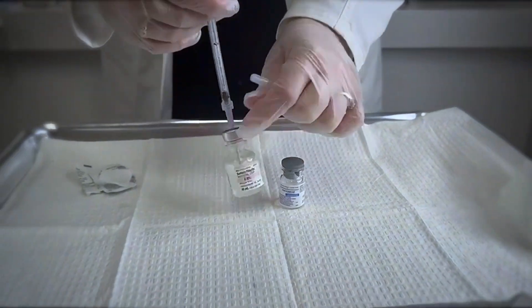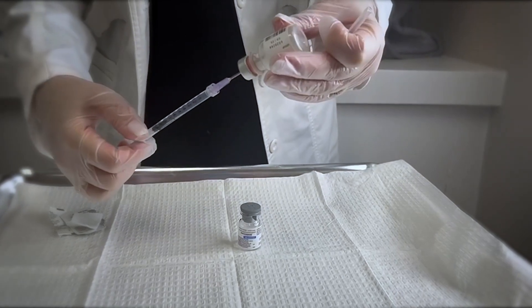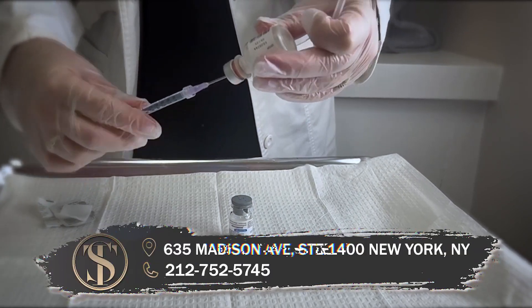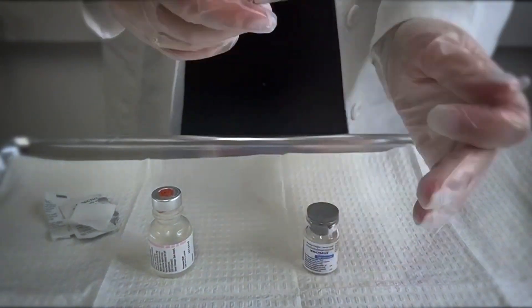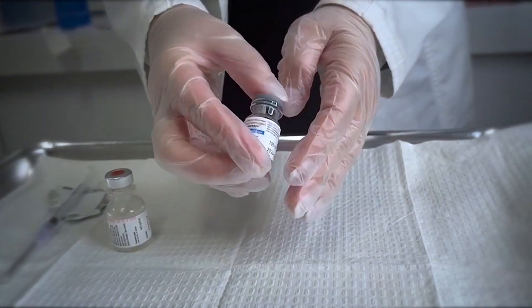Using an appropriate-sized needle and syringe, draw up the appropriate amount of 0.9% sodium chloride solution. Disconnect the syringe from the needle, then gently mix the neurotoxin with the saline by rotating the vial.